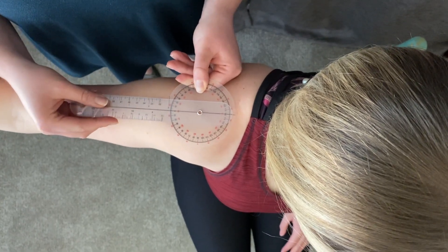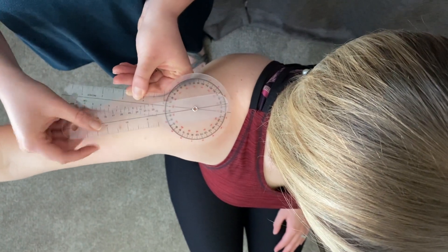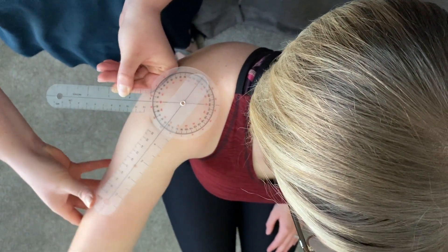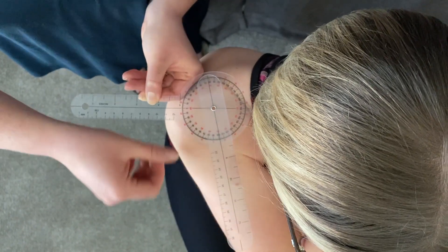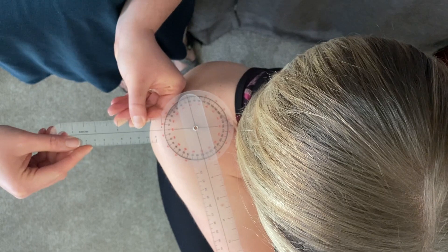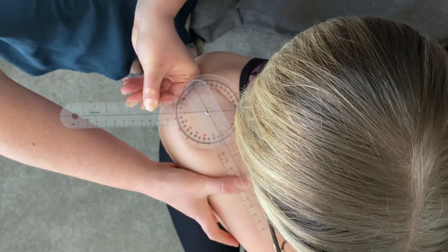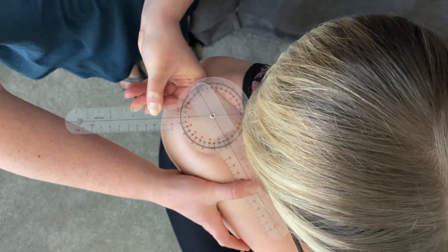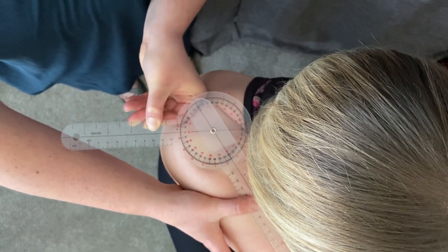You're going to have the patient go into shoulder horizontal adduction. You want to make sure on this one that your stationary arm stays perpendicular to the trunk. Push the patient until you feel that end feel. And we are at 120 degrees.